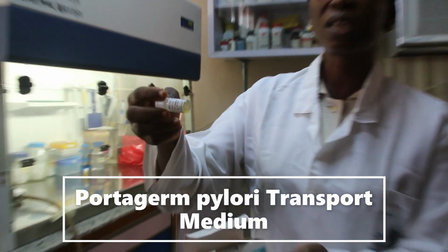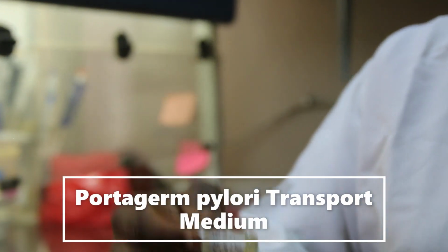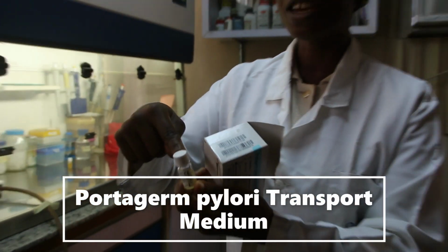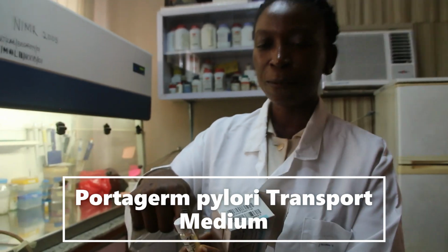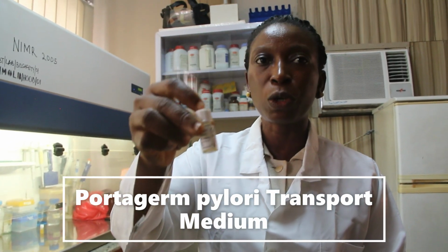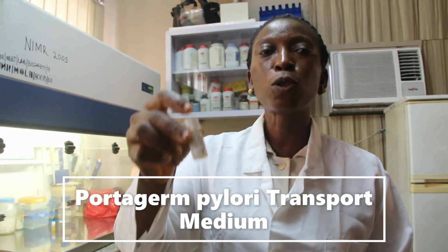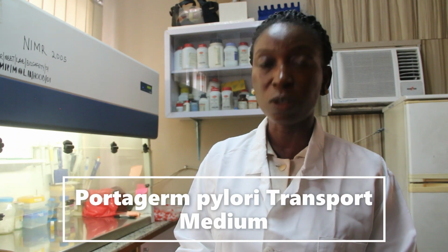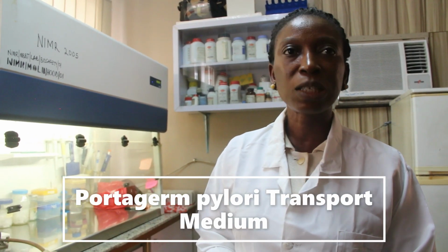While the biopsies are taken during an endoscopic procedure, they will be received aseptically and embedded deep inside the transport medium. Movement of the sample should be within 4 hours, but it can survive up to 48 hours in the transport medium.